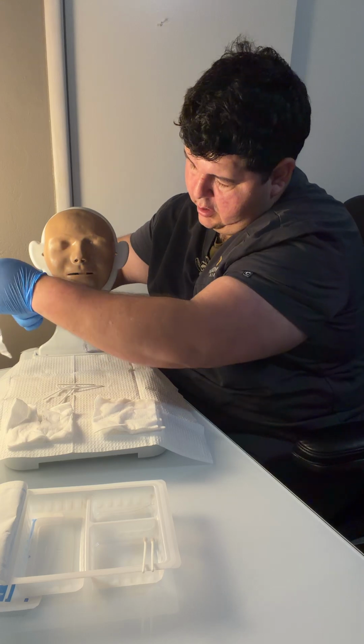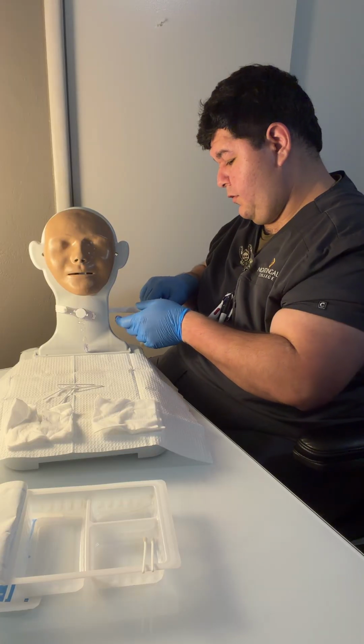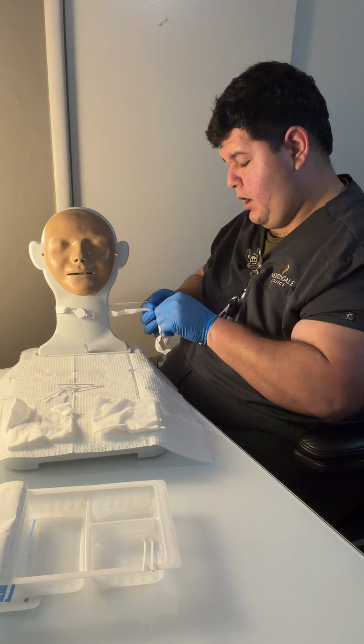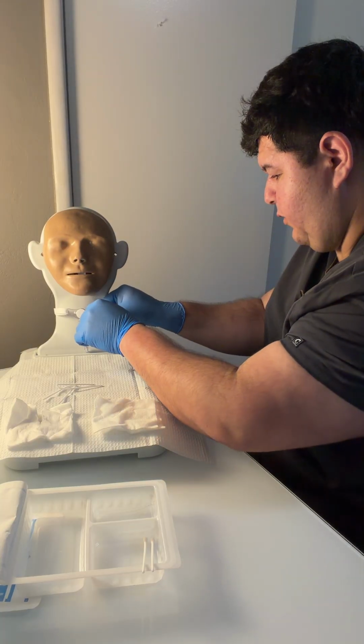So we're going to use our 1 tie, pass it around the back, assuming my assistant's still holding on to my trach as I would want, and it is in place and not shuffling. And then I'm going to pass it through the other hole.